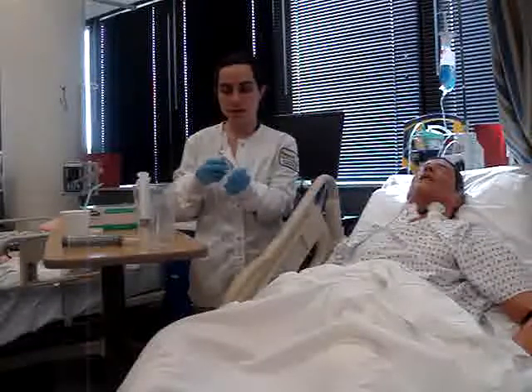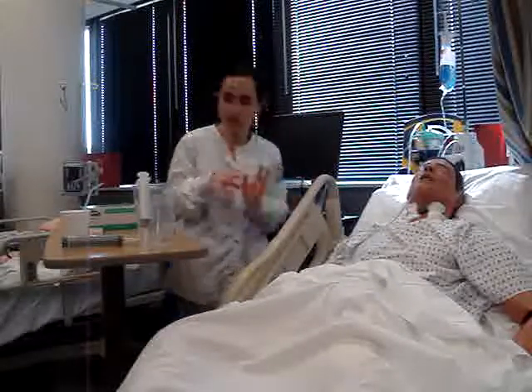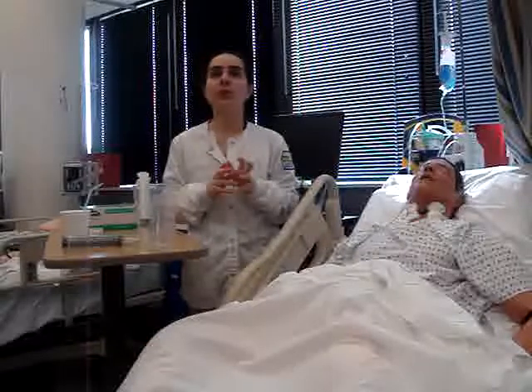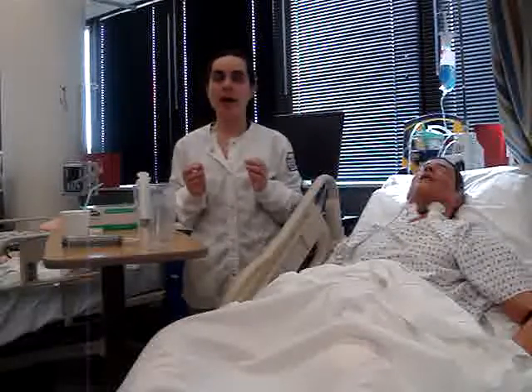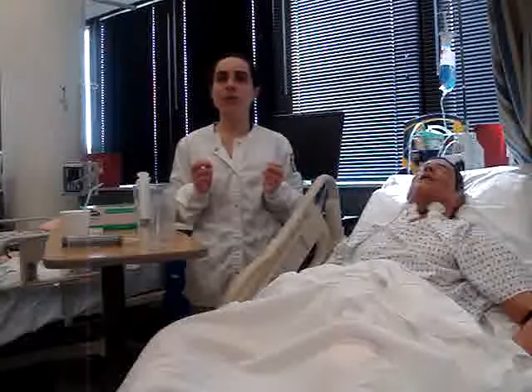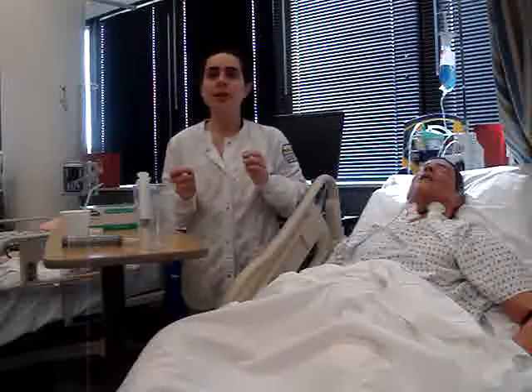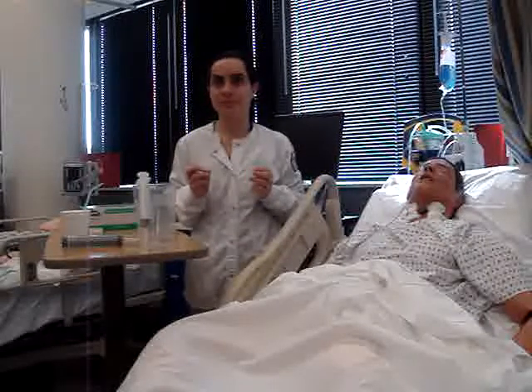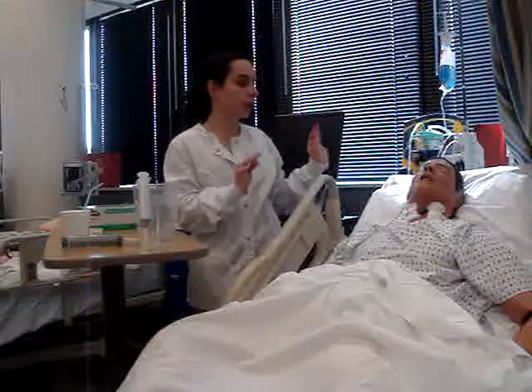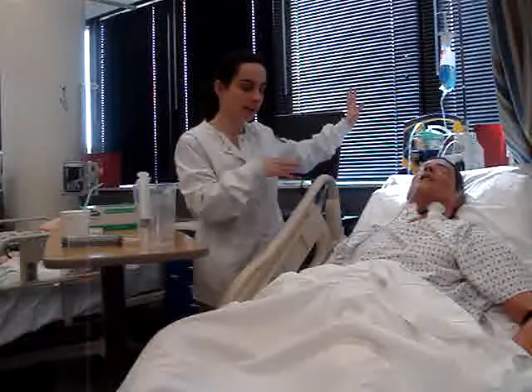I will remove my gloves and perform hand hygiene, and I'll put on new gloves. And administer the feedings. For the open feeding system that I'm going to do first, it will be the feeding bag. I will have labeled the bag and the tubing. I will perform my demographics and also the formula type, the administration method, the time and date prepared, and the time and date that I hung it.